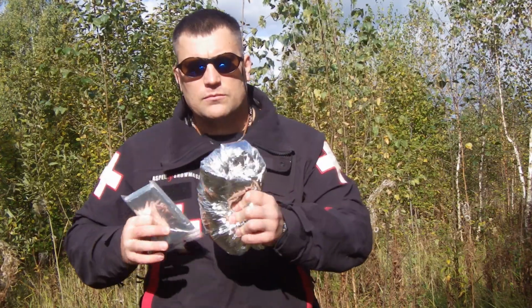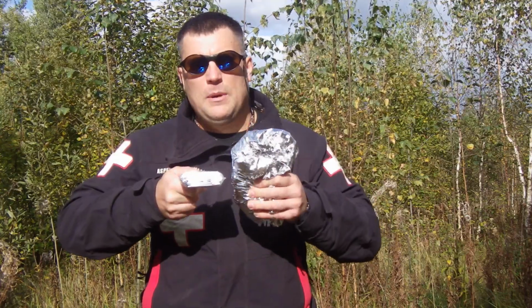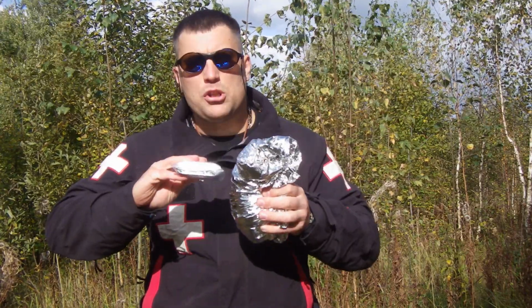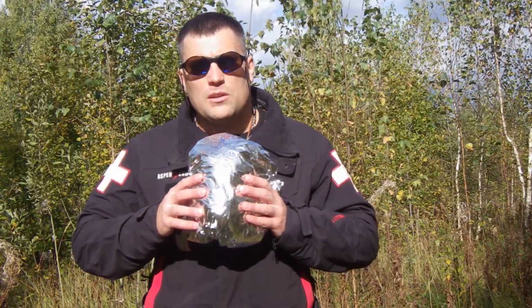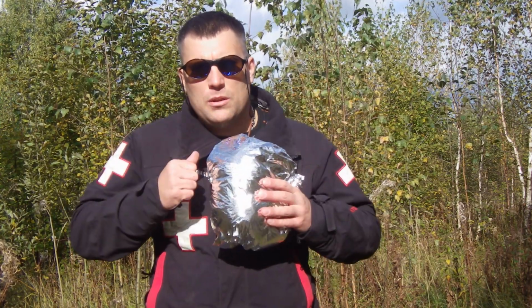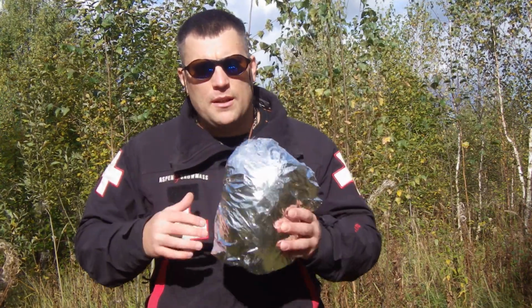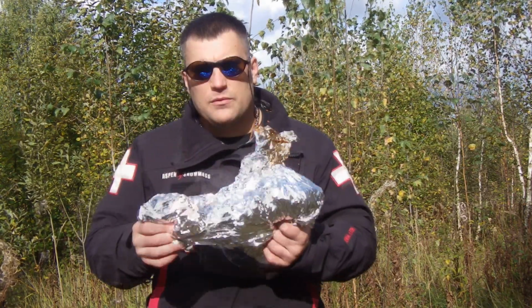It melts from the spark of a fire. When you open it up and use it, and then need to wrap it again a second time, it becomes very bulky, very big, and you can't make it like the previous position. It makes a loud rustle, a very big sound. When you wrap the patient and try to ask him something, he can't hear you because the noise of the space blanket is very big.